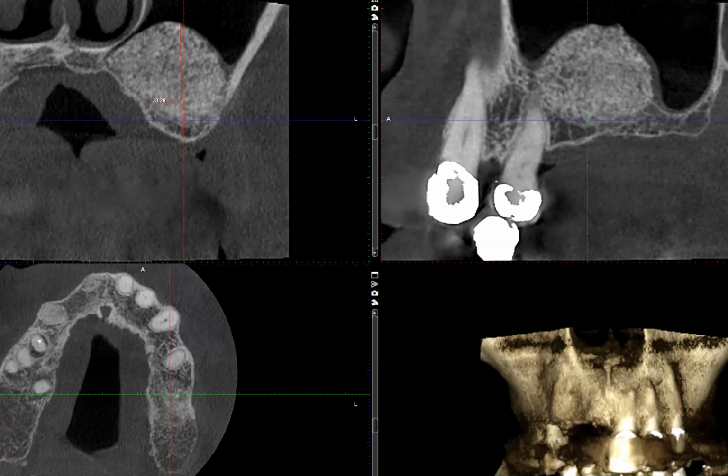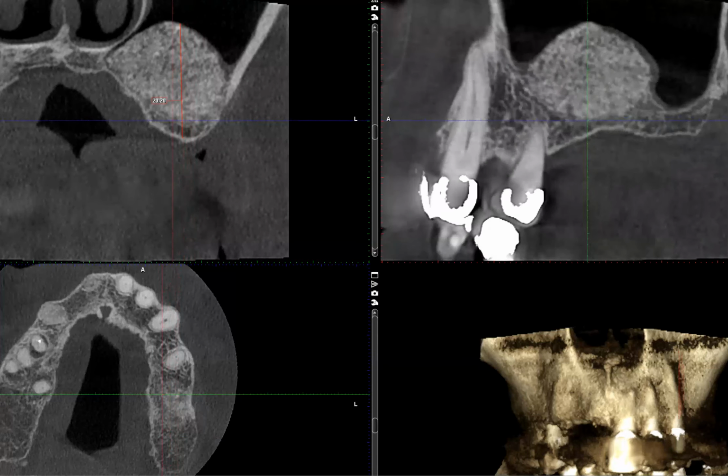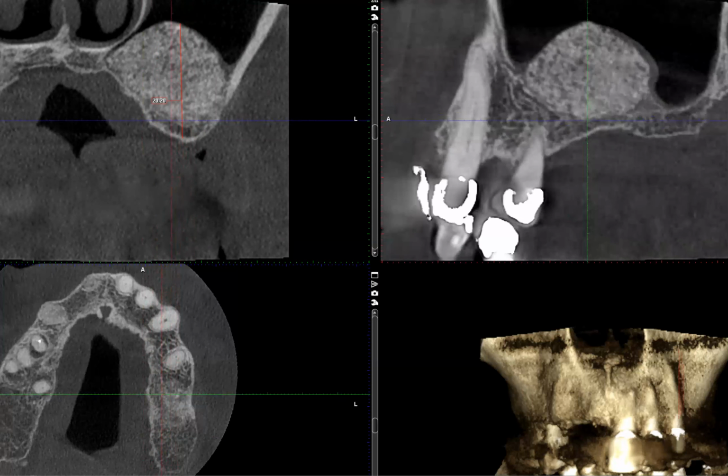So with this type of ridge, you can just about fit in almost all types of dental implants that you can think of. So we effectively gained close to 18 millimeters of the height of the bone at its highest point. So very impressive and very remarkable. And then surgery has gone extremely well for this patient.